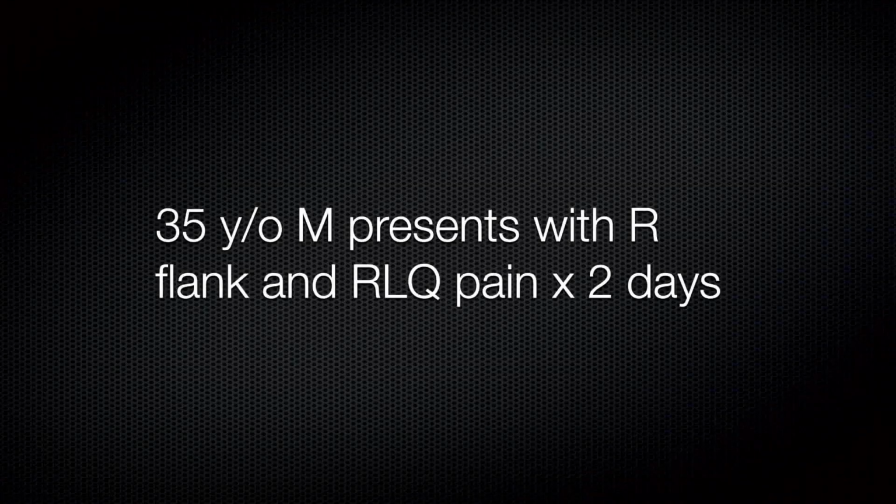Today we're going to talk about kidneys and a little bit about renal ultrasound. This is going to be a pretty good topic. But before we get going too far into just talking about it, let's just dive right on in and talk a little bit about kidney ultrasound. So we'll start this again here.